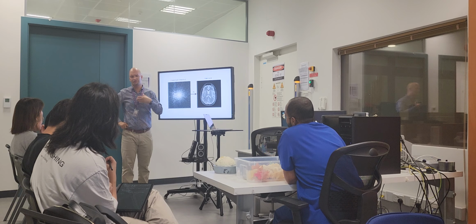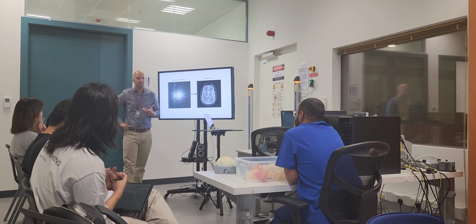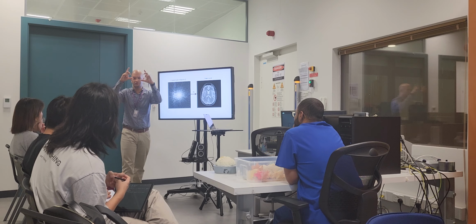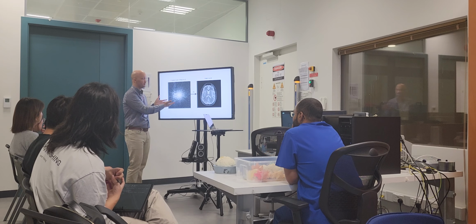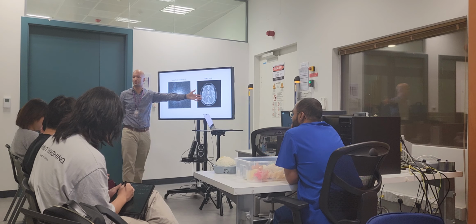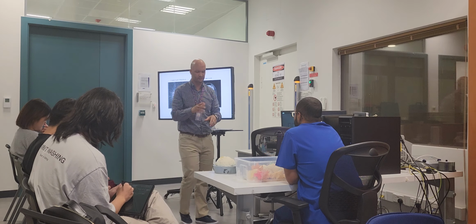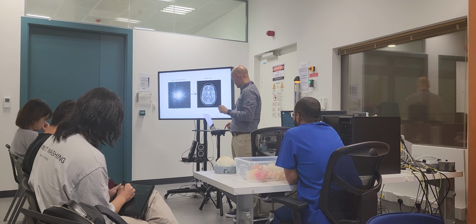The thing I want you to take out, and probably you're already aware of this, is that MRI does not acquire image space. It's not like your phone or your old camera that you take a picture and you print it on the film. That's image space. MRI, and even NMR, collects the data in the Fourier space. We collect the frequencies. And with the Fourier transform, we construct the images. I have a slide for math, but if you need to see it, I can show it to you.